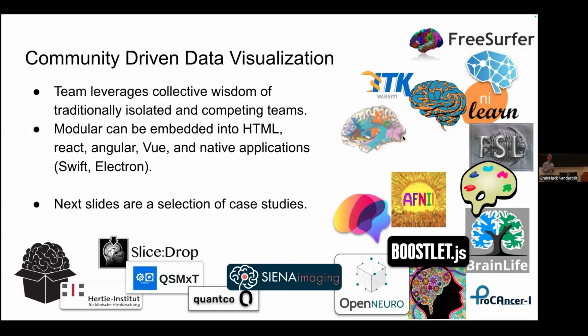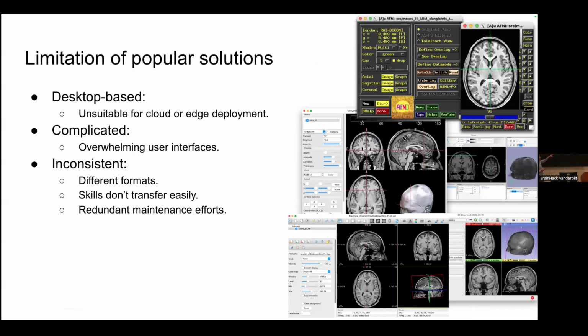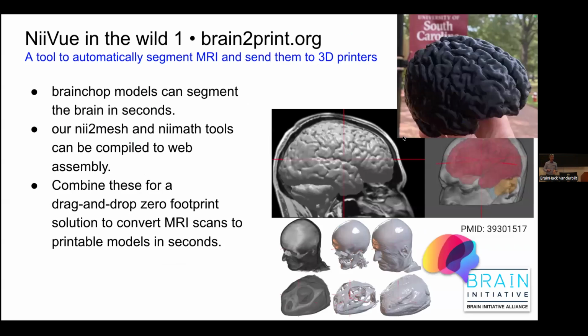And it actually, I would say, solves two problems. I mentioned the vendor lock-in, but it's also worth saying, since each one of our tools tries to do everything, the user interfaces tend to be really complicated and convoluted. And that makes it particularly hard to use different tools. If you think about a very modular visualization tool, you can put it into a solution that has as many or as few widgets or user interface elements to achieve the task you want at hand. And so that's sort of our vision, to have this plug-in modular device.